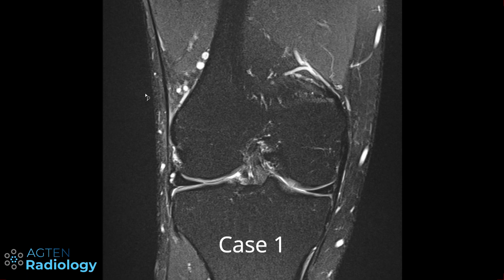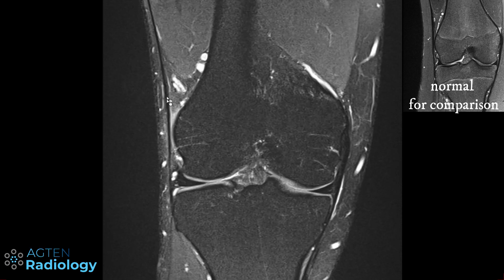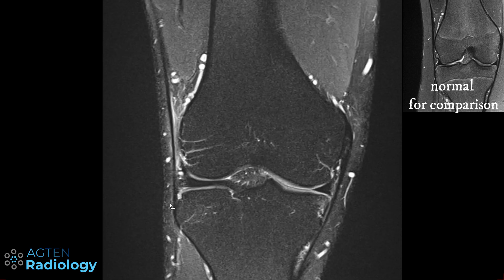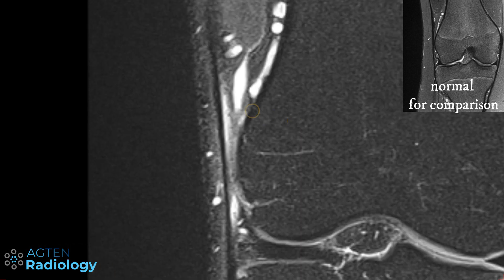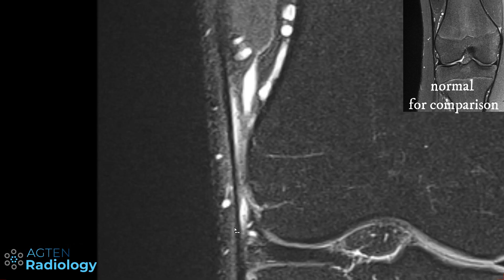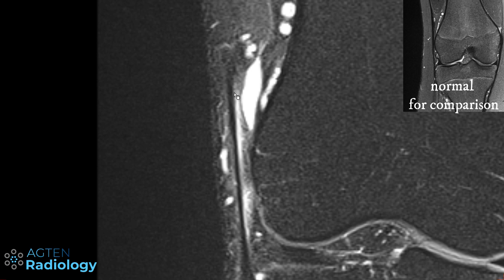Here we have a proton density fat-saturated sequence. Lateral is on this side, medial on the other, and you can see the iliotibial band running all the way down onto the tibia. Between the iliotibial band and the lateral femoral condyle we have edema in the soft tissue, consistent with iliotibial band friction syndrome. You have to be careful not to interpret the normal recesses of the knee joint as a neobursa or adventitious bursa — that is normal anatomy, not pathology.